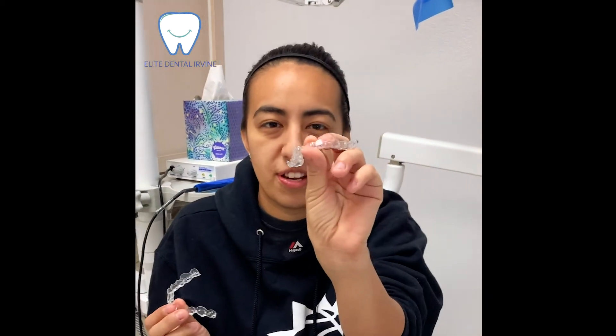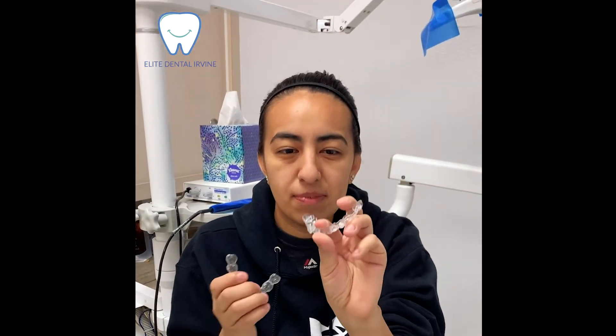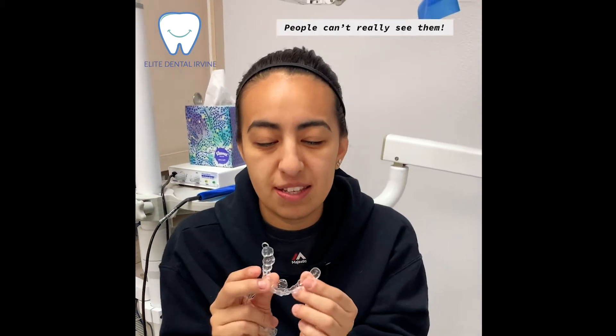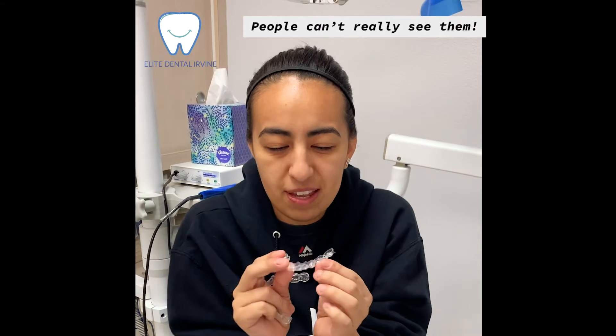So this is a lower tray, and this is the upper tray. It's really simple to put on, and honestly, nobody can see them.